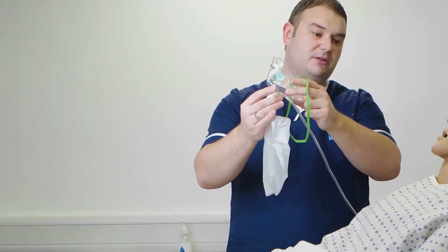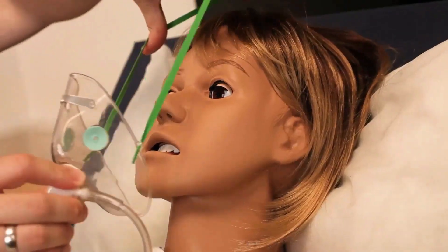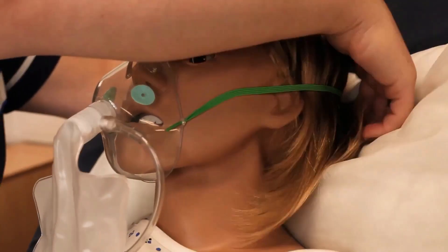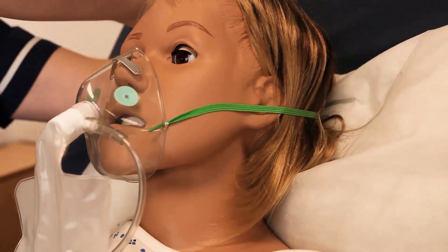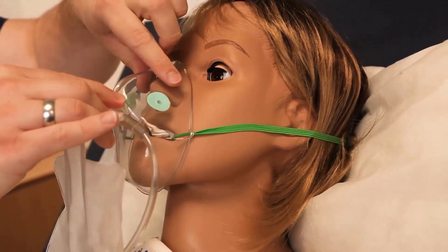Sophie, the next thing I'm going to do is pop the mask on — is that okay? Yes that's fine. We will pass the elastic strap around the head, ensuring that the mask is well fitted and comfortable, and that the mask is well sealed but not overly tight.